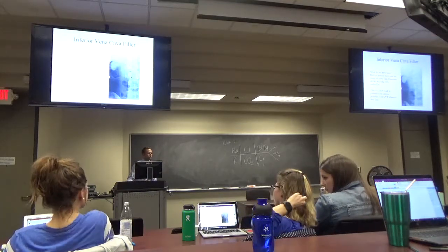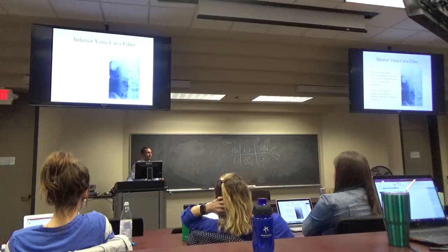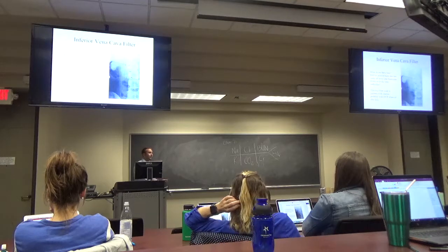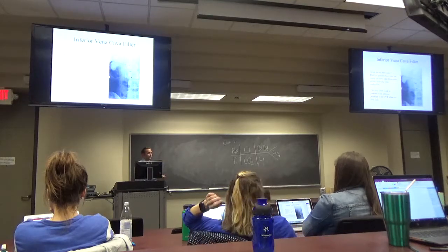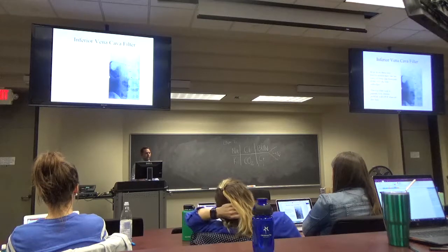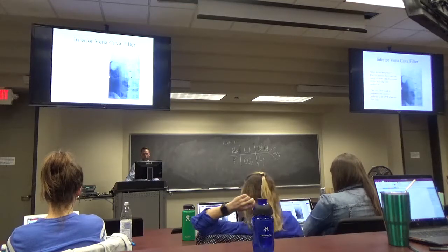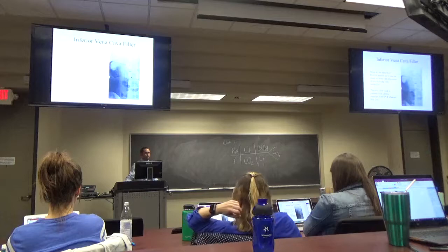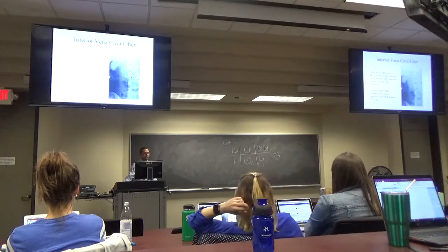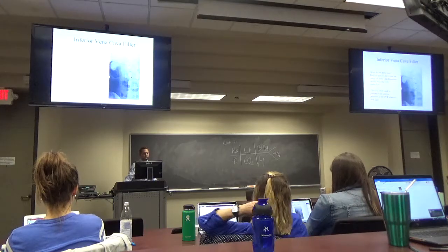So what are the things they use in the hospital, where they put it on and just listen to the flow? That's a classic Doppler technology. They're just looking for a heartbeat in a baby or something. Yeah, that's just a Doppler. Most of the time when we talk about Doppler, it's just using the Doppler settings on the ultrasound machine. They use it for fetal heart tones, and they'll use it on your peripheral pulses too. So if you're worried about peripheral vascular disease and circulation, you're going to check in the emergency room or in your clinic, look at Doppler, because everybody's usually going to have one in their primary care area, but not an ultrasound machine.